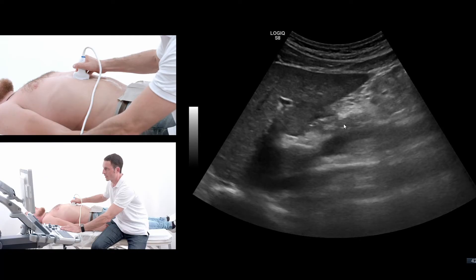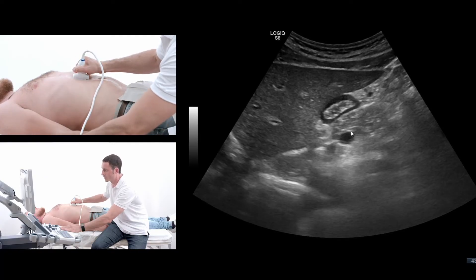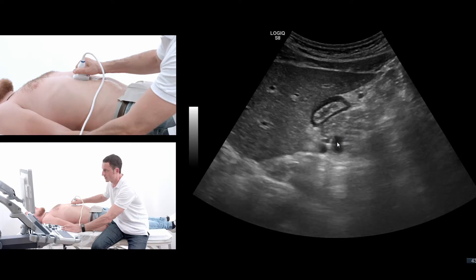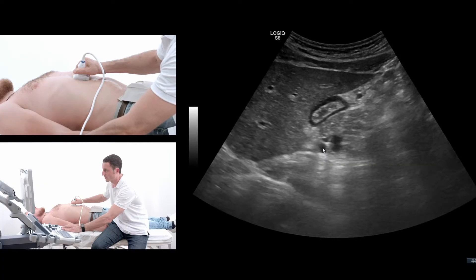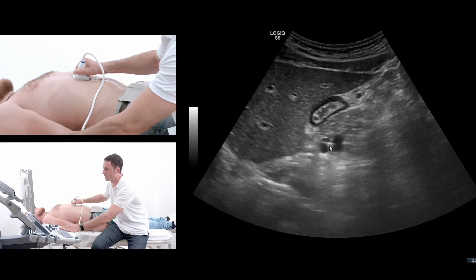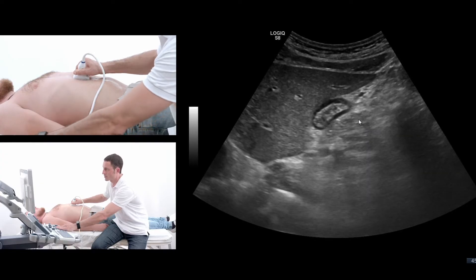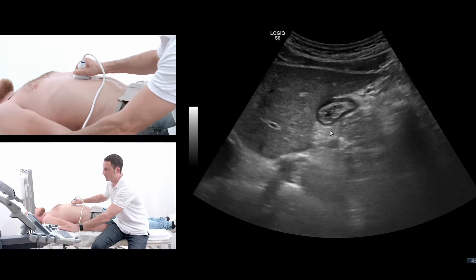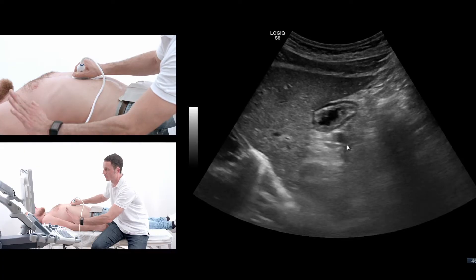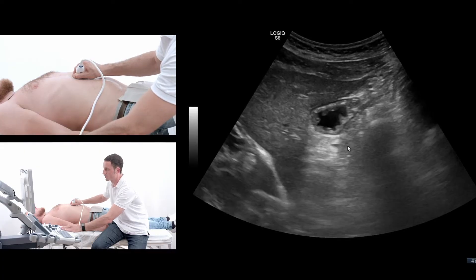I can move the probe more to the left side of the patient and I can see that the splenic vein and the splenic artery, which is more cranial to it, go back. And with this, the pancreas tail goes back to the splenic hilum.